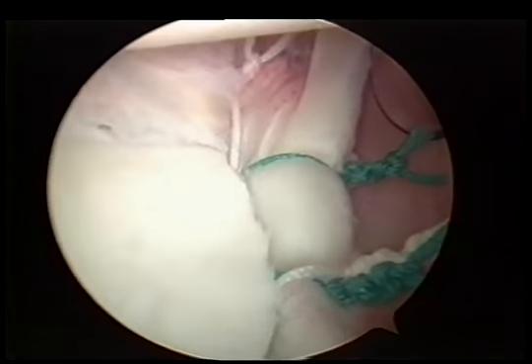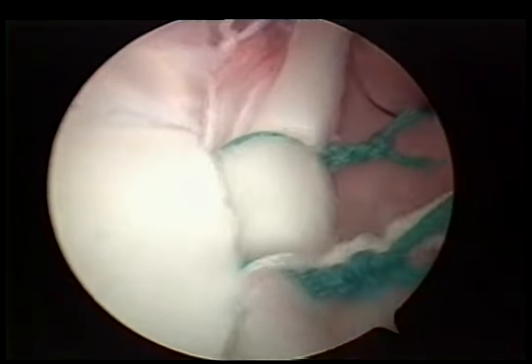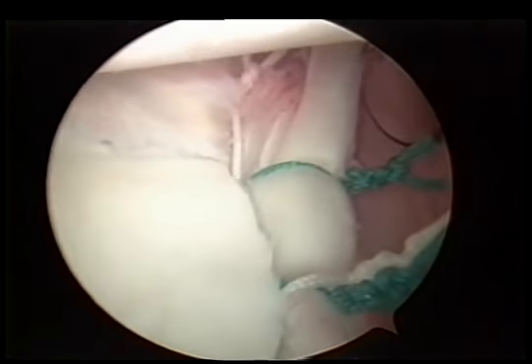You'll see the biceps will move, but the labrum doesn't medially displace at all. Nothing peels over the edge of the glenoid. We've totally negated the peel back.